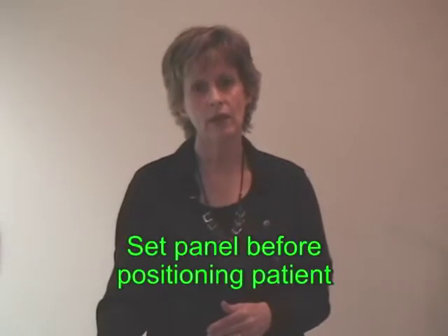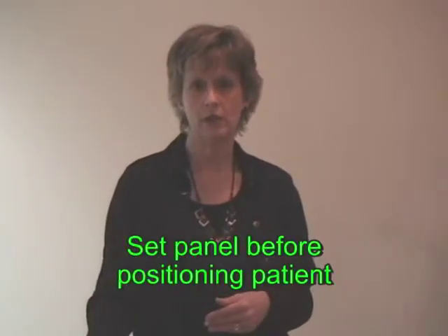Many hospitals have photo timing or automatic exposure controls. That's another lesson in itself, but with automatic exposure controls, you select a photo cell, select the kilovolt range and backup time, and when you make the exposure, the machine will actually terminate when it reads an appropriate amount of density on the film. You still have to set certain things on the panel, but it terminates when the appropriate density is there. Okay. Again, you set the panels before you position the patient.